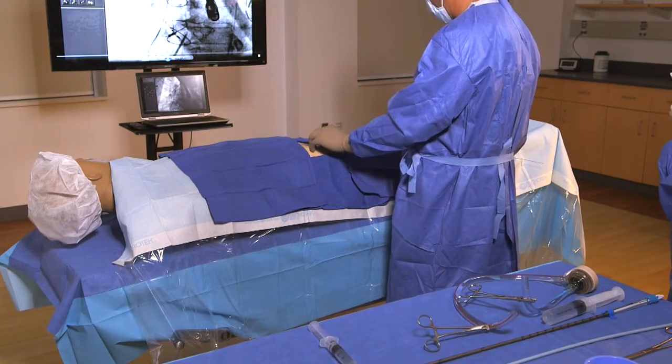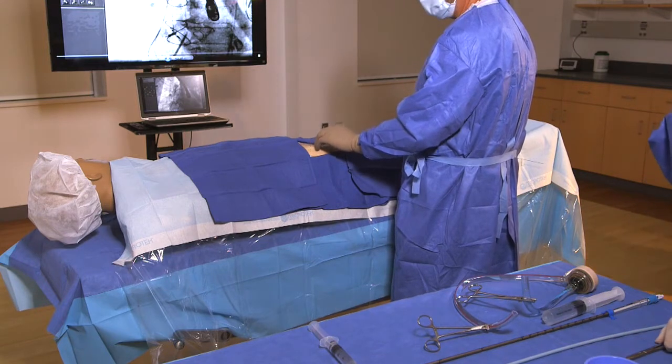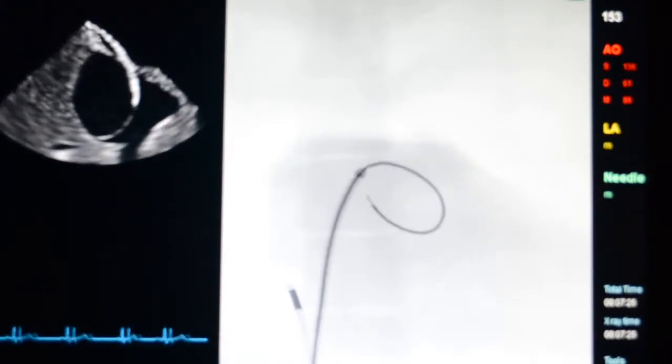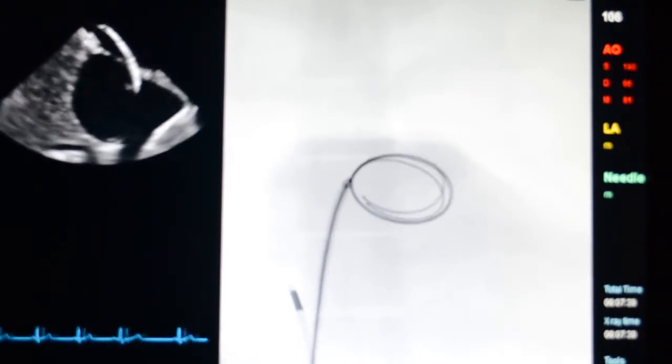Use a standard transeptal puncture technique to gain access into the left atrium from the femoral vein. Introduce the guide wire through the needle and into the left atrium. Then remove the transeptal needle and mullens sheath.